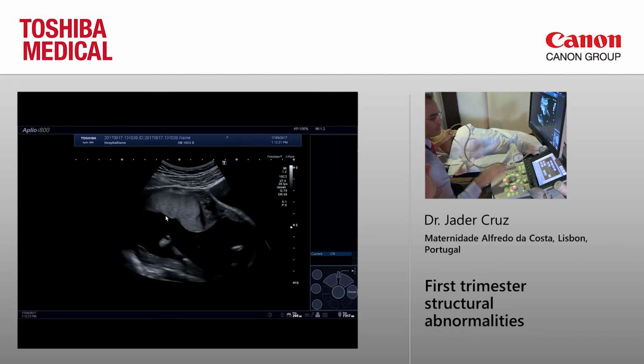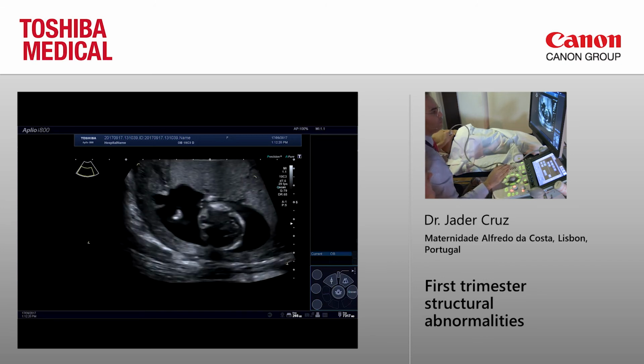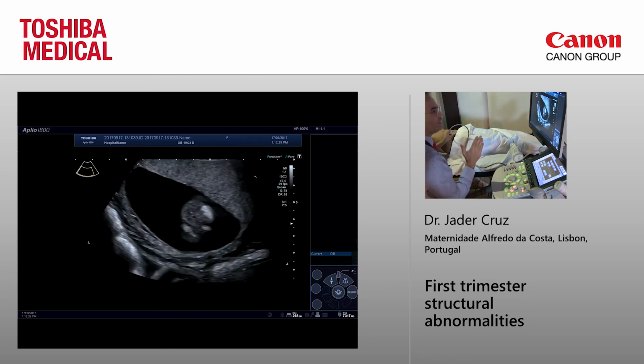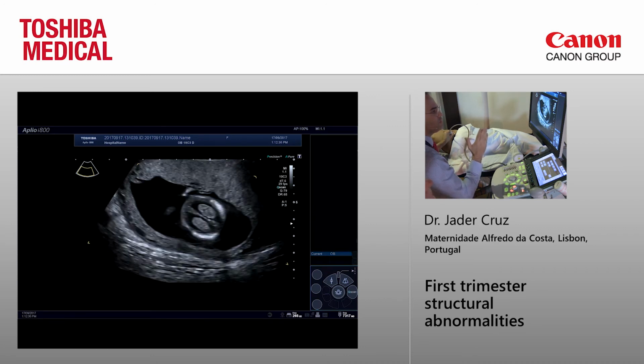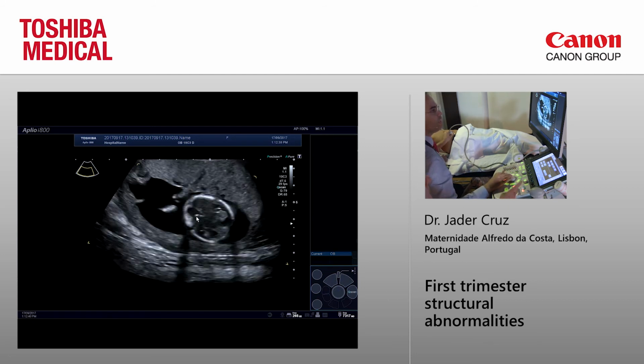That's a good start. And then we move to the baby, and as I told you, we always start from the top of the head, and in a very slow movement, we just scroll to the bottom. You see the skull, you see the brain inside.